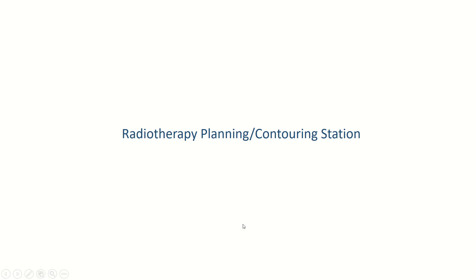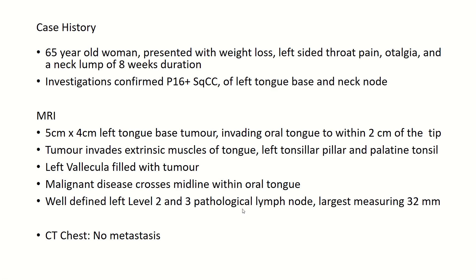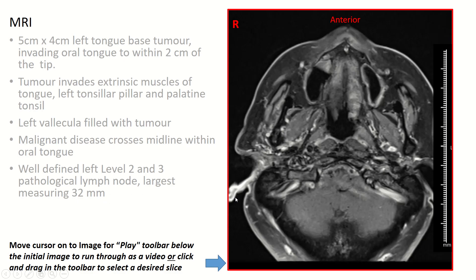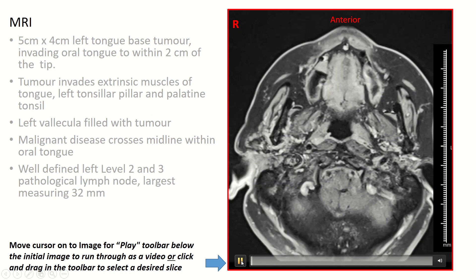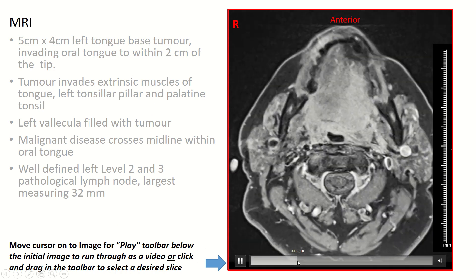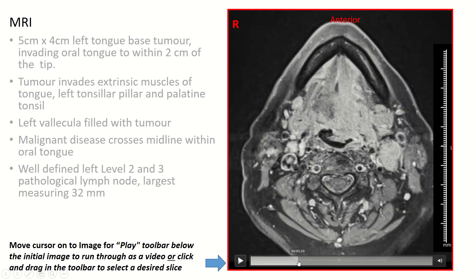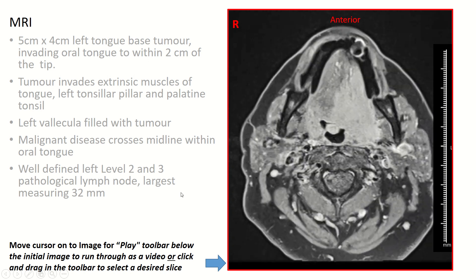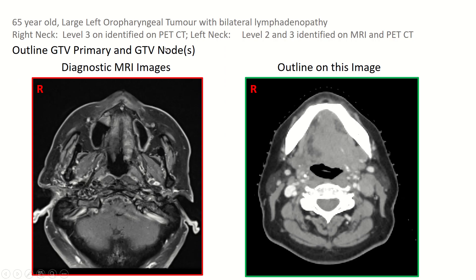The timing for this station starts now. A brief history will be given, followed by the image data set with the report on the left. Get the cursor to the image data set and click. You can also left click and drag. Once you have gone through the images and understood, you can move to the next slide.